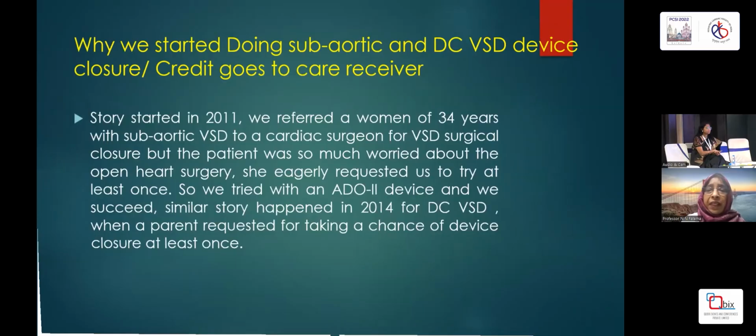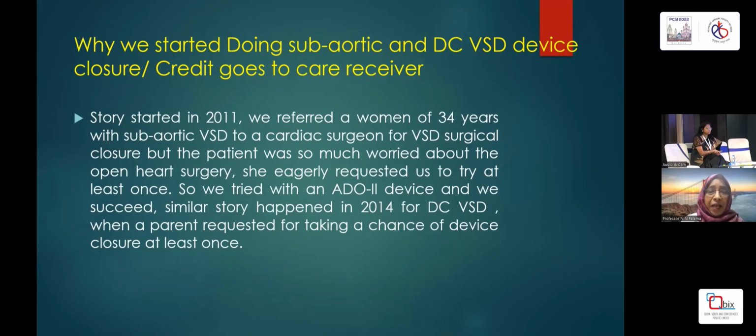So why did we start doing this kind of VSD closure in our center? I must say the credit goes to the care receiver who was our first patient. The story started in 2011 when we referred one of our female patients, 34 years old, to a cardiac surgeon, and she returned with frustration.